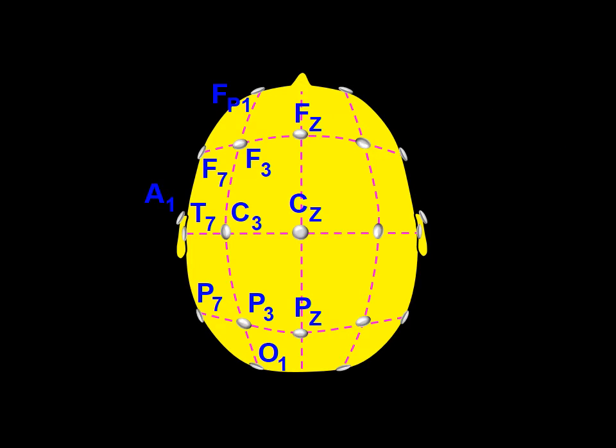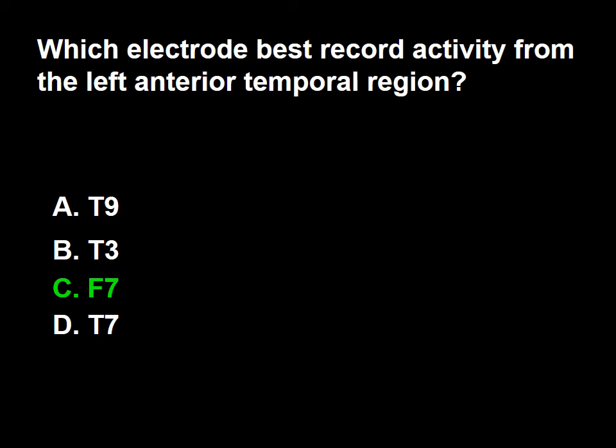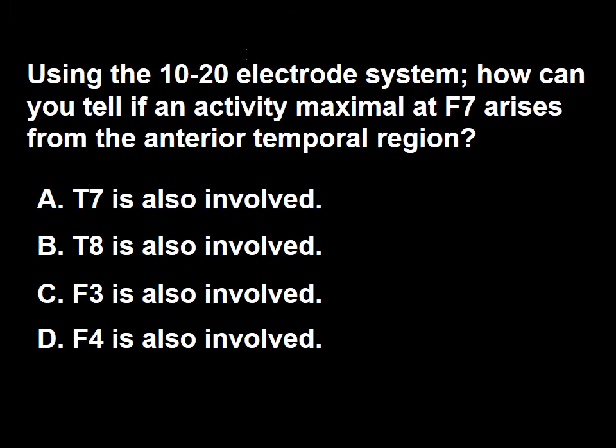This is a view of the head from above. The most commonly used electrode sites are indicated. The line just added represents the central, and the semi-elliptical structure represents the contour of the left temporal lobe and the right temporal lobe. So the answer to this question is C.